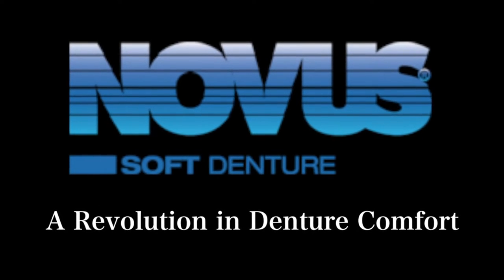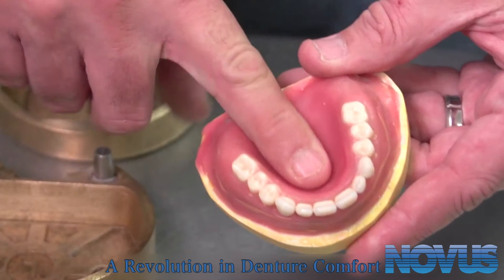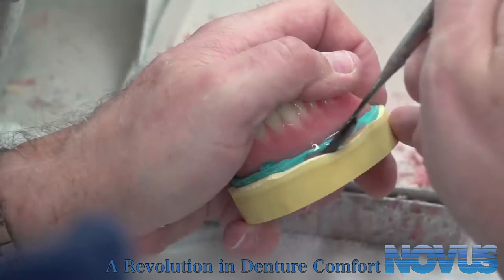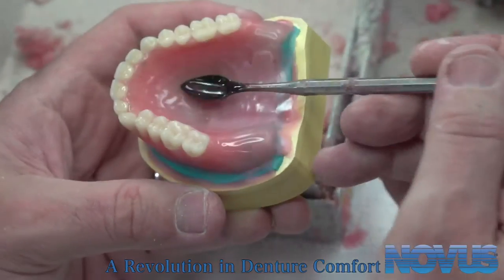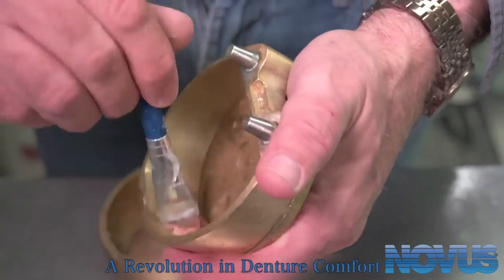Instructions for use for the Novus Compression Flask Reline. Start by evaluating the working denture to determine if there is a need to thicken it in any area to accommodate the needed thickness for the Novus. Add wax or other material to thicken the impressed denture at the lingual, buccal, or any other place that is too thin. Next, invest the denture in a compression flask.